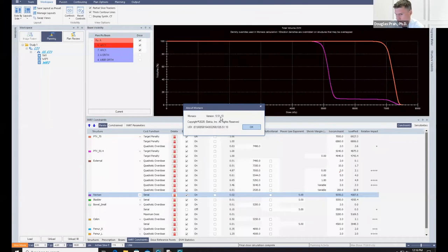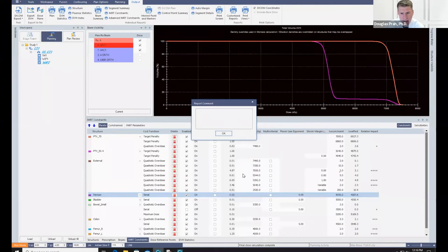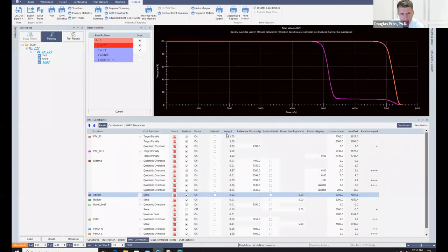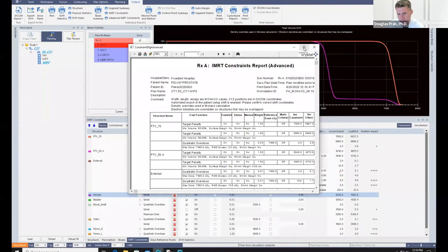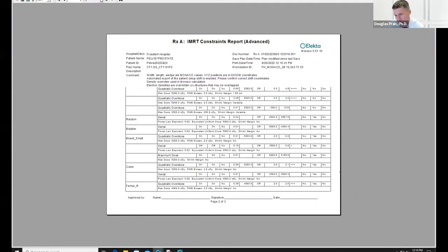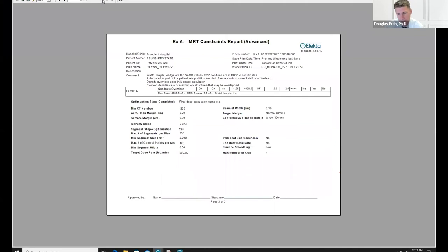I don't know what everyone's got. I think Elekta is up to 6, and we're probably going to be doing an upgrade sometime in the future or not. But I have no problem giving you screenshots. I can send you the advanced IMRT constraints for a couple of our plans to show you what we have, and this will spell out everything: shrink margins, surface margins, everything. It would probably be best if you started with something like this and built onto what you had, but then you can at least see what we did.